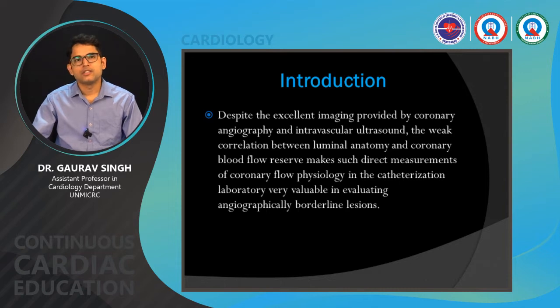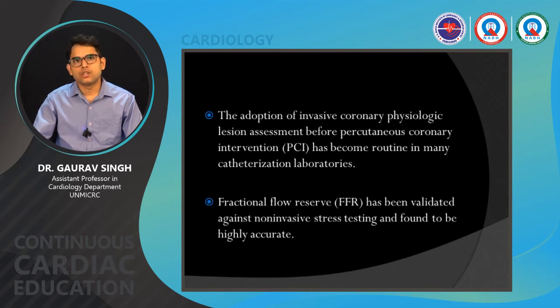Why do we need FFR? Despite the excellent imaging provided by coronary angiography and IVUS, there is a weak correlation between the luminal anatomy and coronary blood flow reserve, which makes direct measurement of coronary flow physiology in the cath lab very valuable in evaluation of angiographically borderline lesions. So adoption of invasive coronary physiologic lesion assessment before PCI has become routine in many cath labs, including ours. FFR has been validated against non-invasive stress testing and found to be highly accurate.